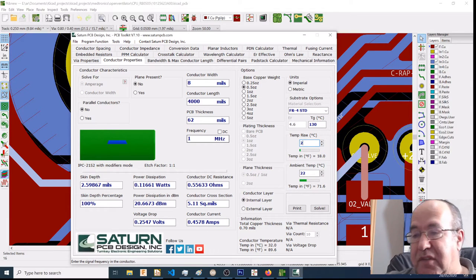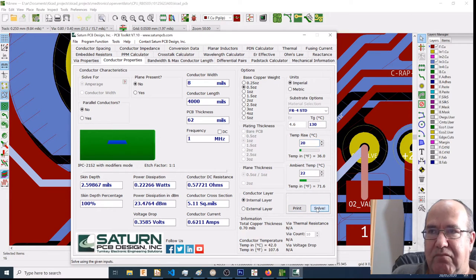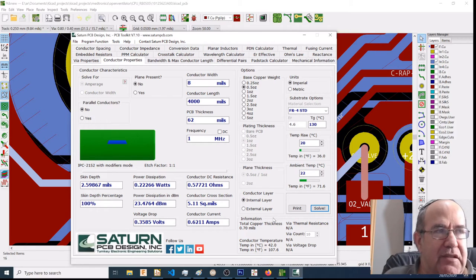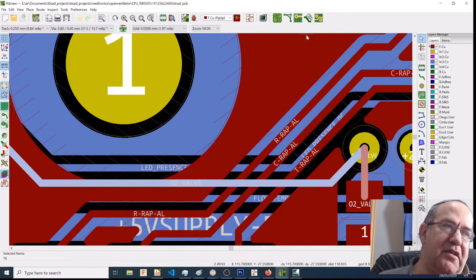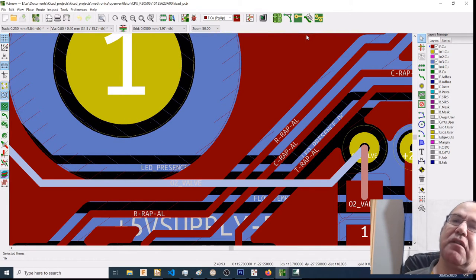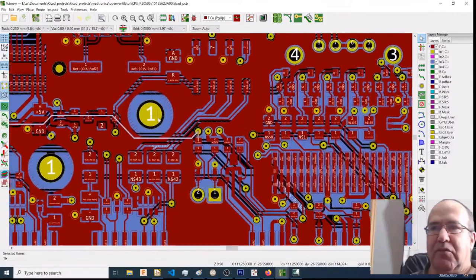If I allow it a 20 degree temperature rise, which is not great for a medical device, I can get to 0.6 amps. It is okay, but not great, judging by the fact that this is not an on-off, it's pulse width modulated. It's more than likely okay on an 8 mil trace.